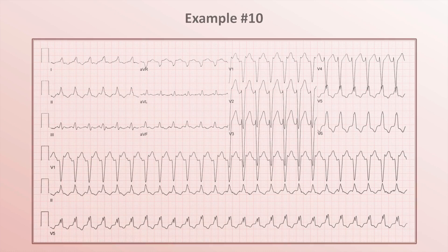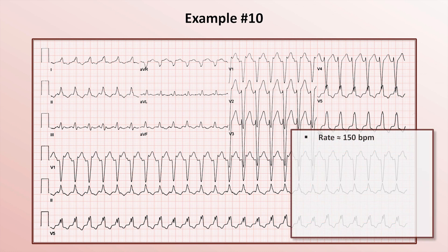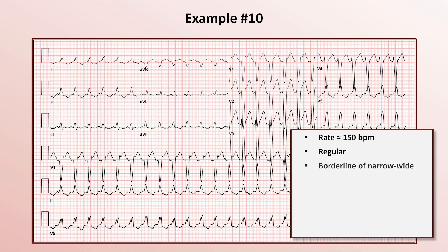Finally, example 10. The rate is about 150, and it's regular. Regarding the QRS complex width, it's just at 120 ms, straddling the border of narrow or wide complex.